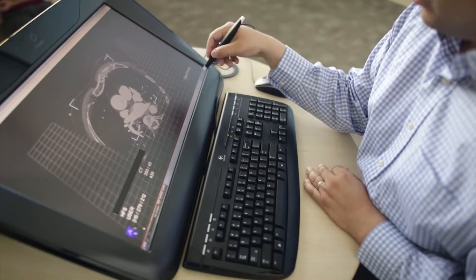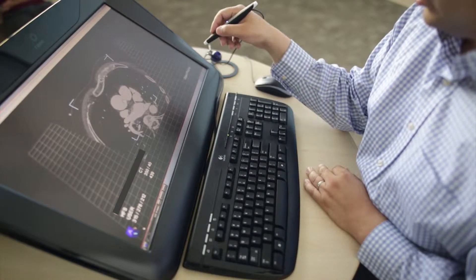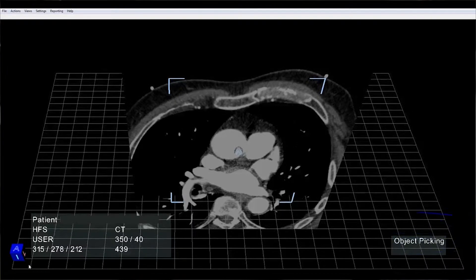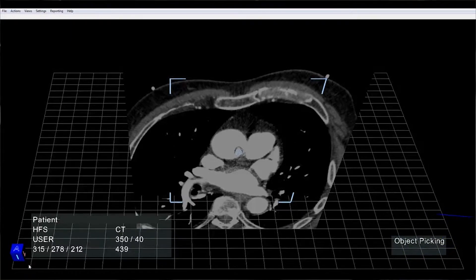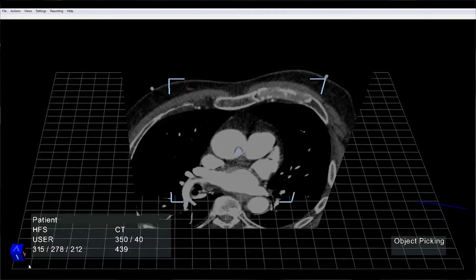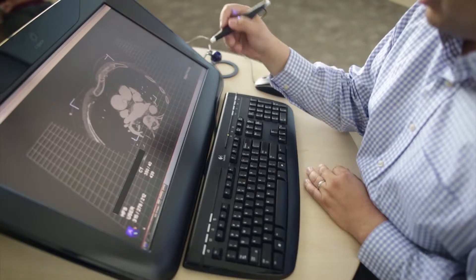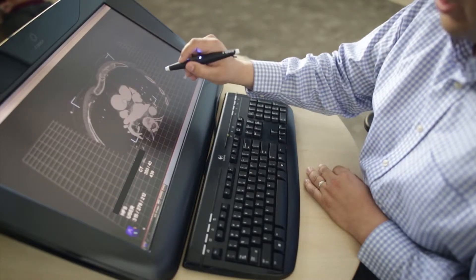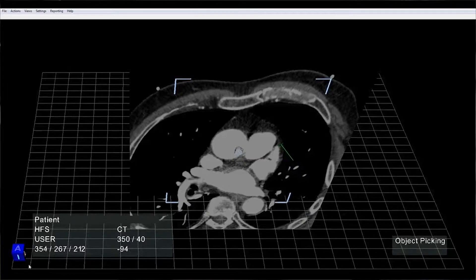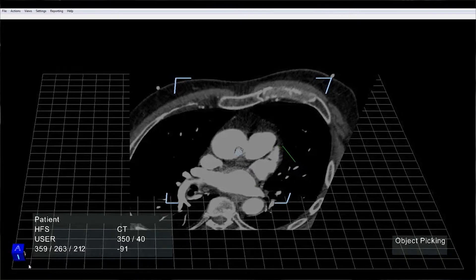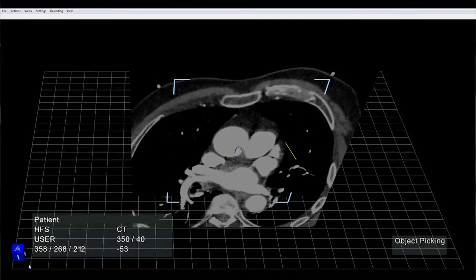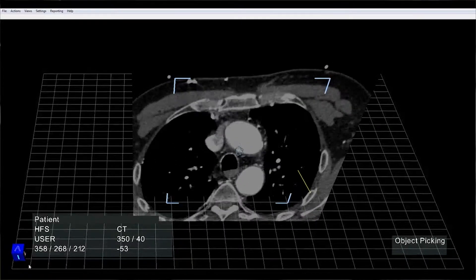On the lower right corner, you'll see another information panel showing the interaction mode that you're in. The default interaction mode is object picking, which means you can reach in with the stylus, touch something, feel the vibration, and the ray will go green — that's when you can press and hold the front button to interact with the data.